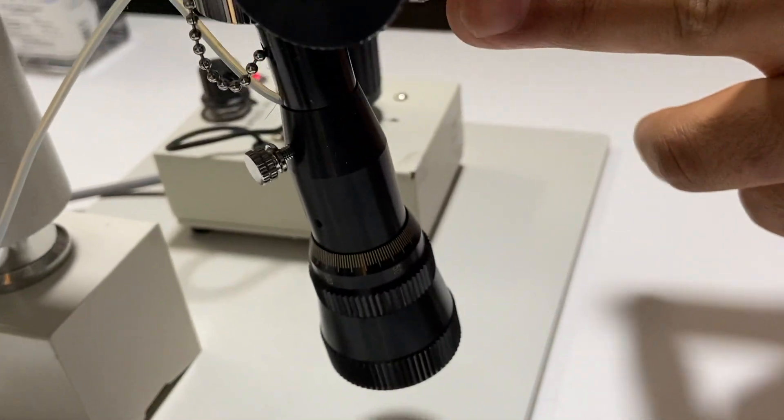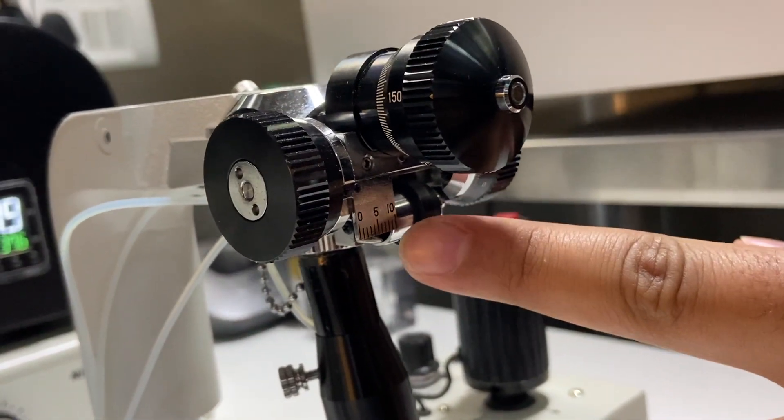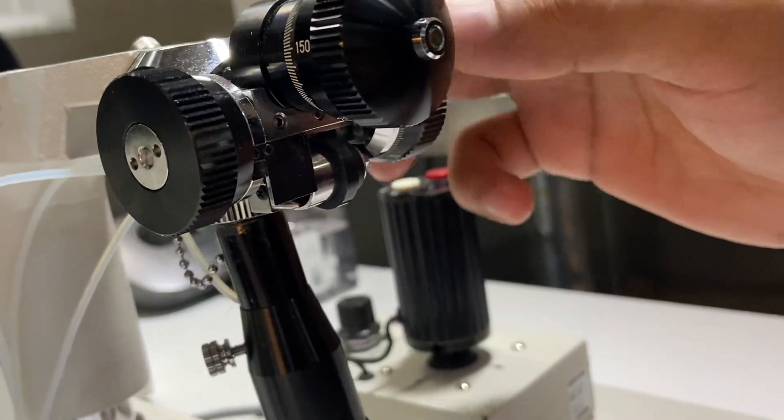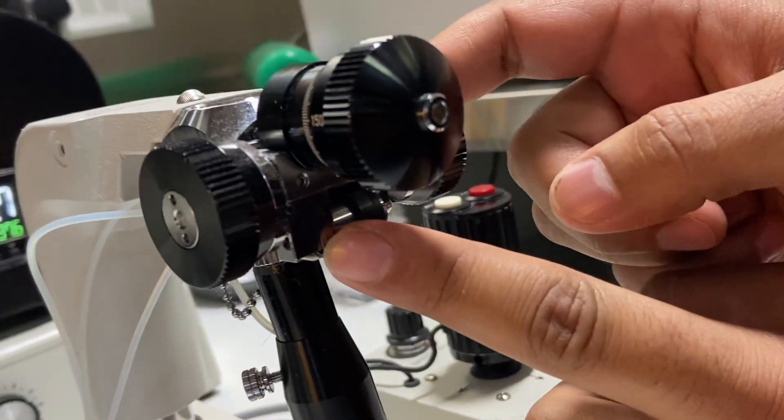Similarly, if you see from the bottom, you have zero, you have five, you have ten. So this also needs to be always on the five direction. So I will move it and this now is almost on the five.